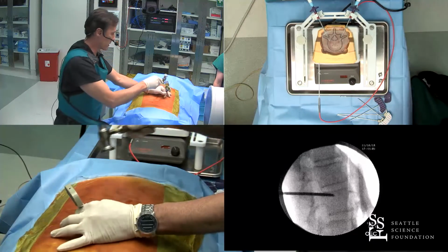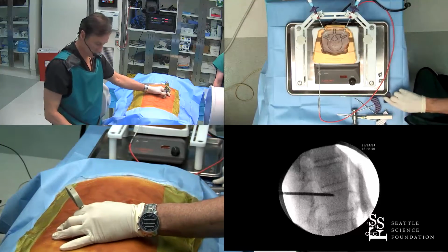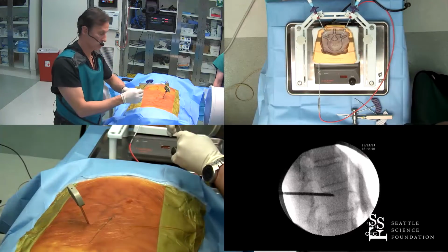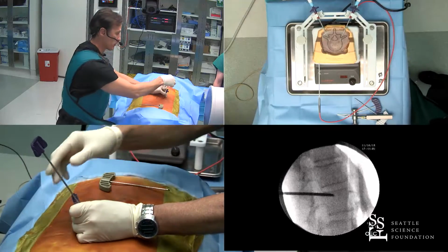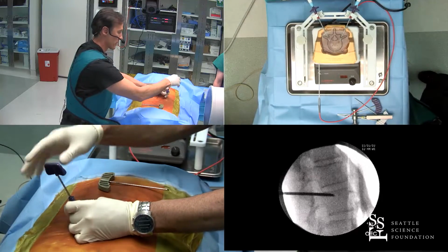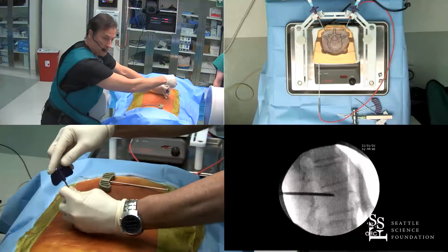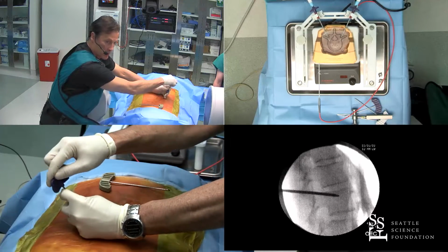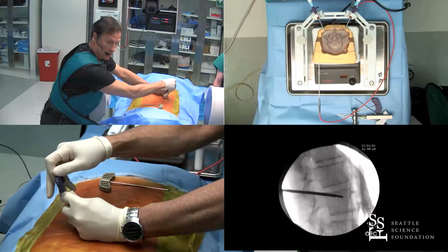And I'm going to take this in about this direction. I'm going to use the drill to drill out the anterior portion, to 3 to 5 millimeters from the anterior portion of the vertebral body. Here's the drill, and I'm going to just use intermittent fluoro.